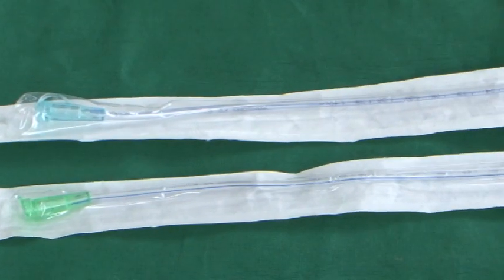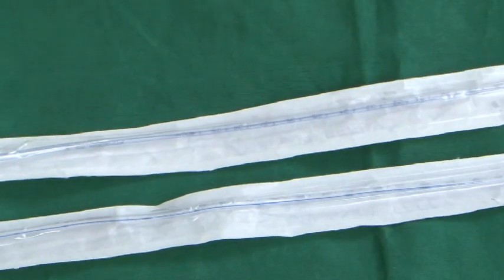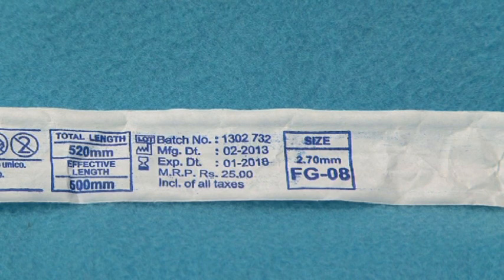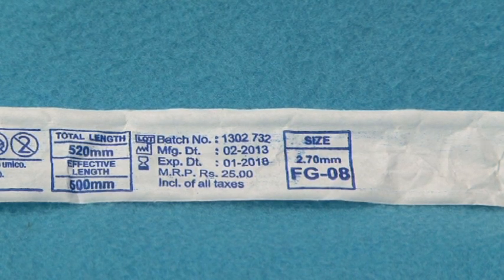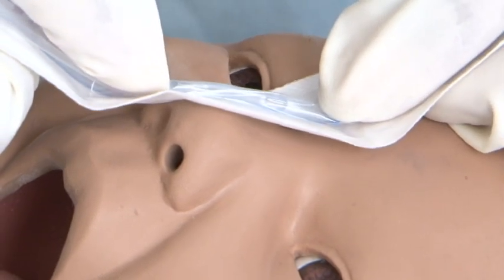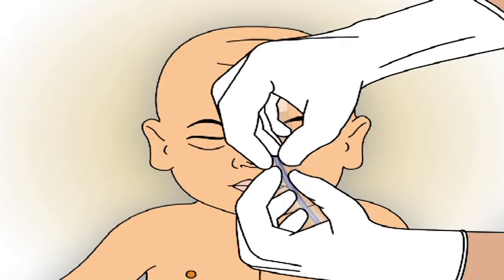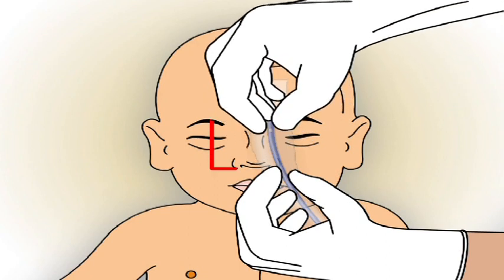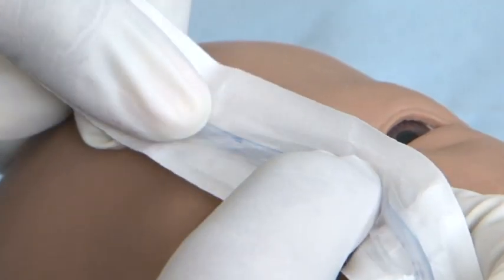Nasal catheter. Use appropriate size of catheter. 6 French for a small baby and 8 French for a big baby. Measure the distance without opening the protective covering from the nostril to the inner margin of the eyebrow, and note the graduated mark on the tube.